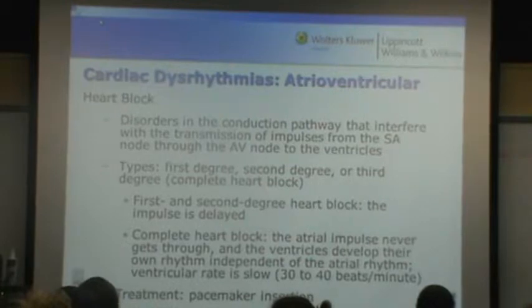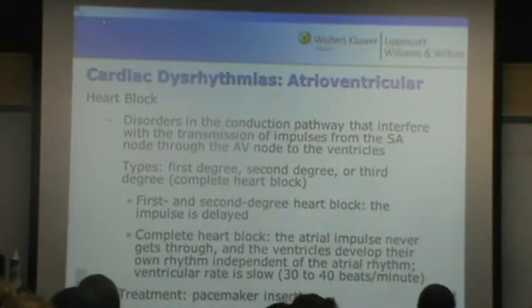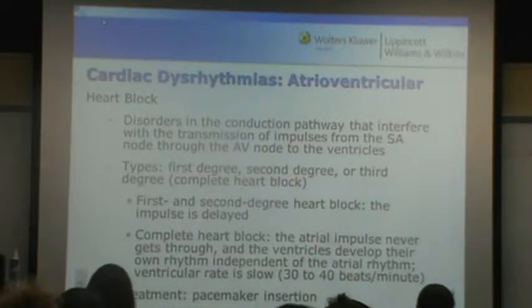Waves, normal, upright. All right, QRS looks good. So do me a favor and write normal sinus rhythm on that one.